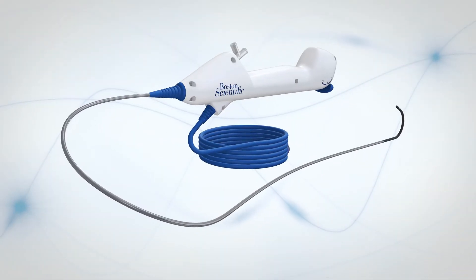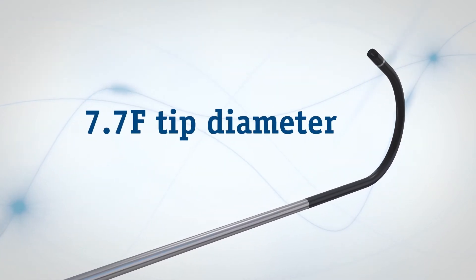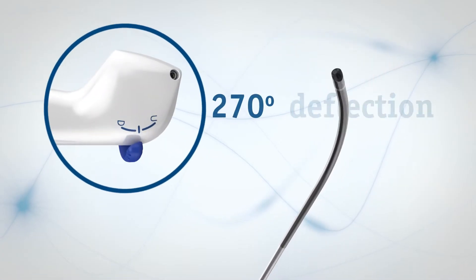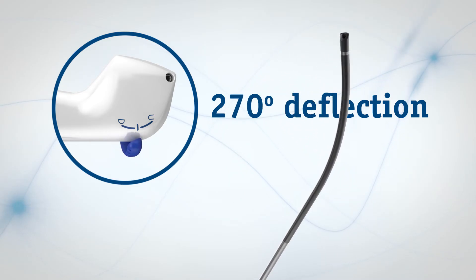The LithoView FlexScope is flexible by design. A digital chip in the 7.7 French tip produces quality images. Along with full 270-degree tip deflection in both directions, the system allows you to navigate toward the targeted treatment area even in difficult anatomy.